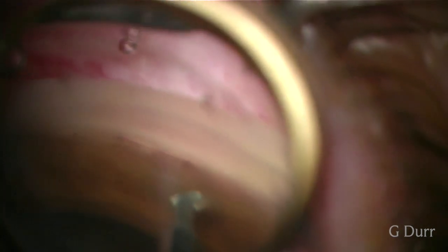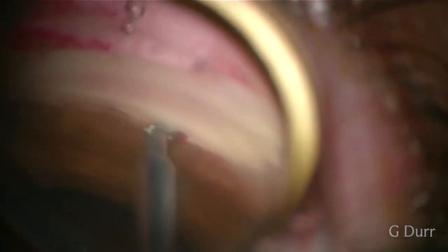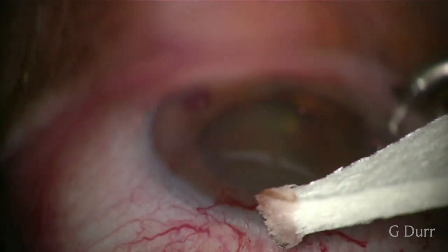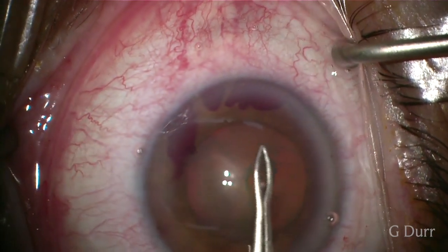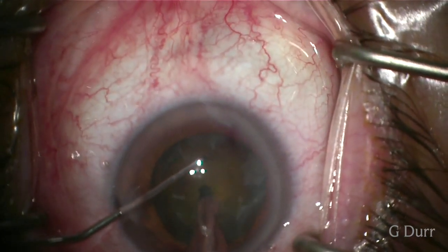We can go completely opposite — going on the left side and then on the right side — allowing for about 90 degrees of trabeculotomy. It's quite smooth in its entry coming in and out of the canal, giving us a nice strip. When going back within that area of excised trabecular meshwork, it's really a nice area that is devoid of any meshwork remaining. We then examine our strip, which shows the majority of the trabecular meshwork that has been removed.